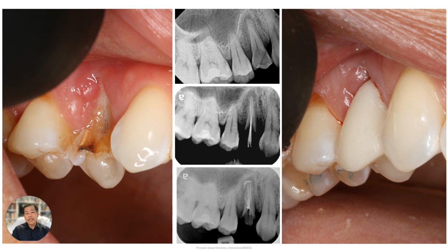So this patient came in. You could see that she had broken off the buccal cusp, had broken off half of the buccal portion of that tooth, and it's been like this for a while. She's been a patient of ours now for about 30 years, but the last time I saw this patient was probably 15 years ago or even more. And she said she's just been busy, hasn't had time to take care of her teeth. So she comes in and she goes, can you take care of this tooth? Because when she smiles, she sees this area.